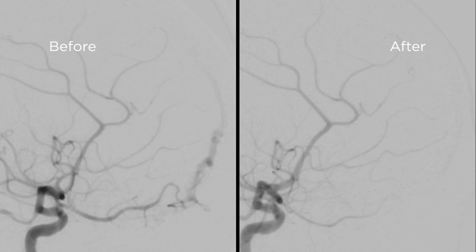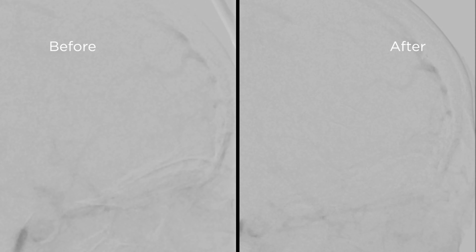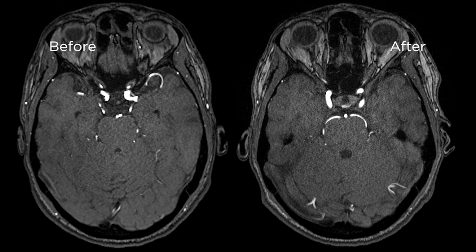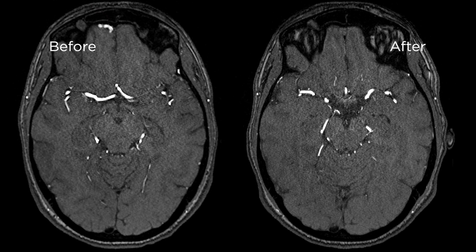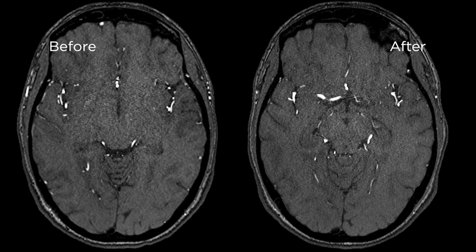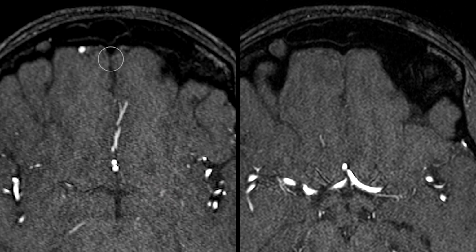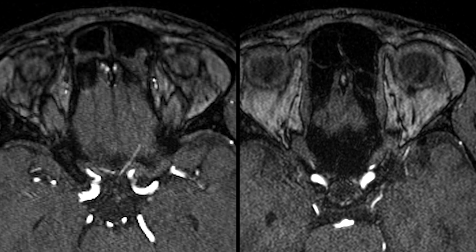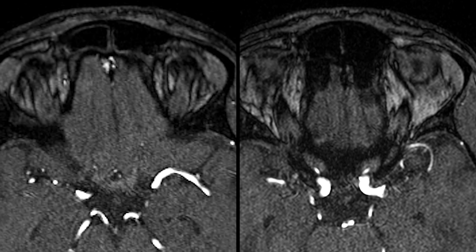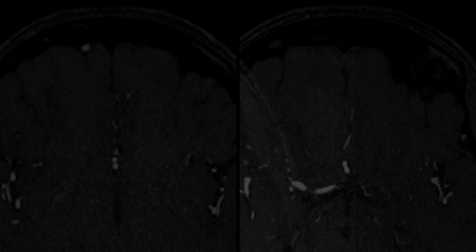Also from the lateral side, you can see we don't have any contrast in the fistula anymore after embolization, and this is a 3 months follow-up with MR angiography, where you can see that it's completely treated. We don't have any residual fistulous vessels. Also in this case, we had some edema directly after treatment in the right frontal lobe, but in the 3 months follow-up, the images were without any edema, without any bleedings, and the patient didn't show any symptoms after treatment.